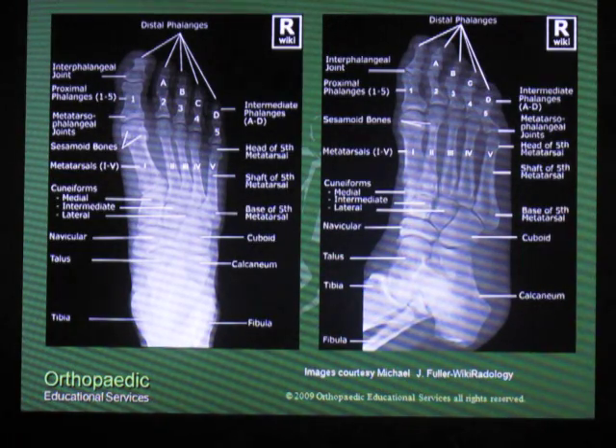On the x-ray images you see now, the Lisfranc joint is comprised of the metatarsal shafts and then the first, second, third cuneiform and the cuboid. On the AP view, the first metatarsal shaft and the cuneiform line up, the second metatarsal shaft and the second cuneiform line up.